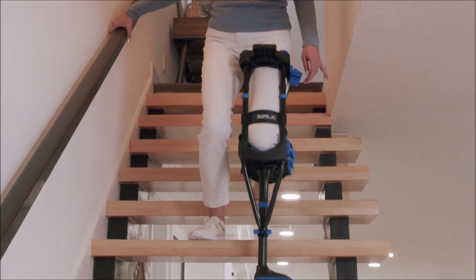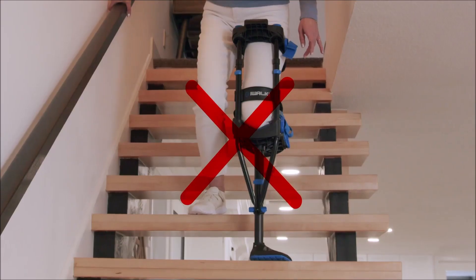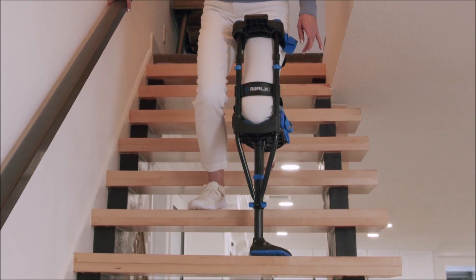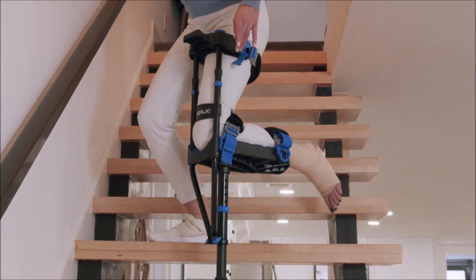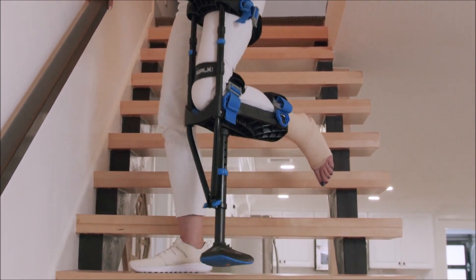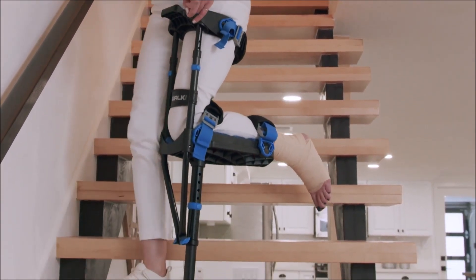Start with your iWALK leg. You cannot go straight down the stairs because your injured foot may hit the uphill step. Instead, turn partially sideways before descending. This allows your injured foot to clear the uphill step. Follow with the good leg and continue descending.